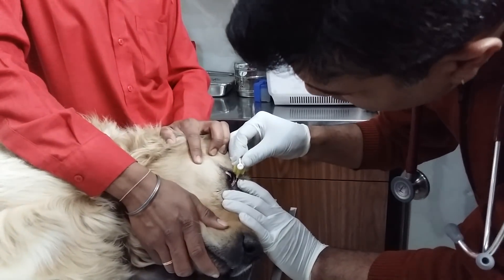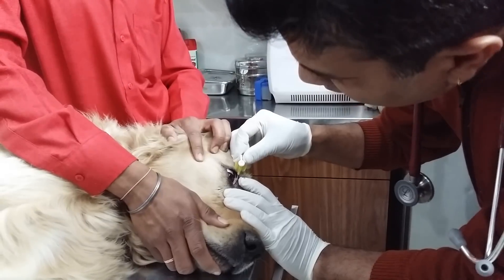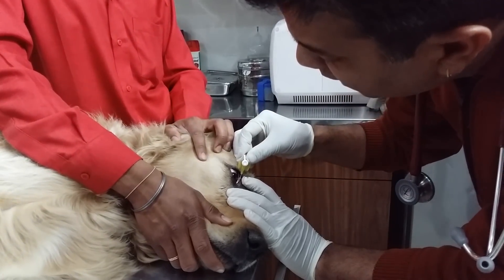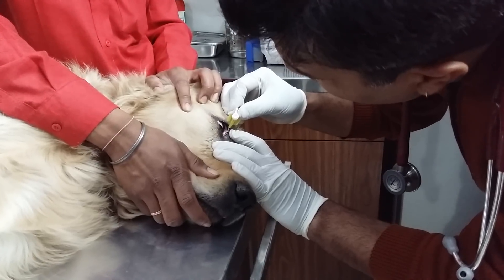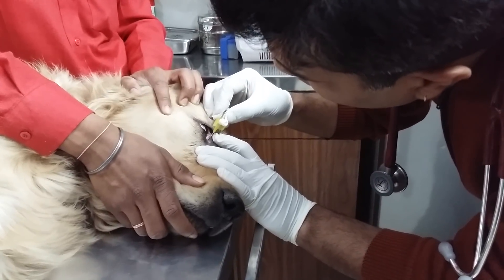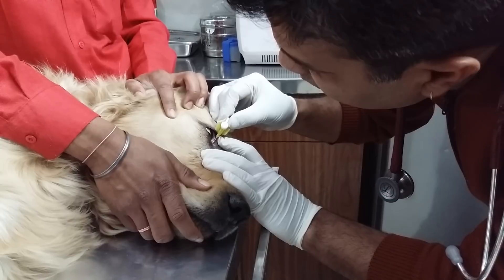I will demonstrate passing this small cannula into the upper eyelid. Near the medial canthus, there is a very small opening in which I am trying to pass this cannula. I got the opening and now I am pushing it in.